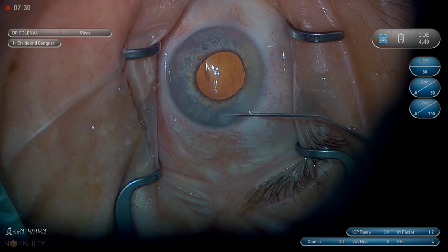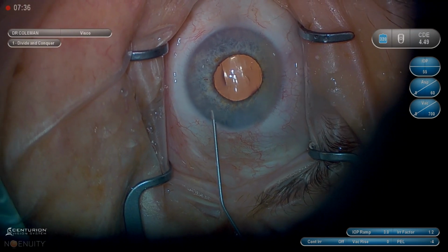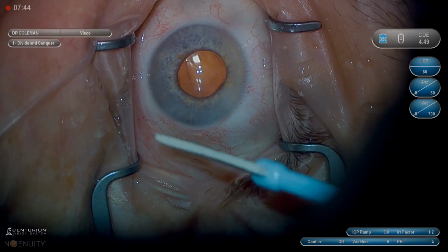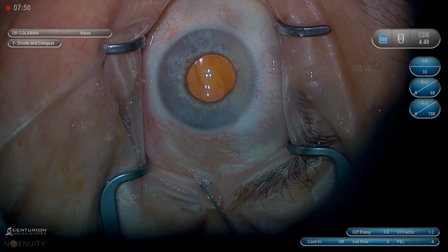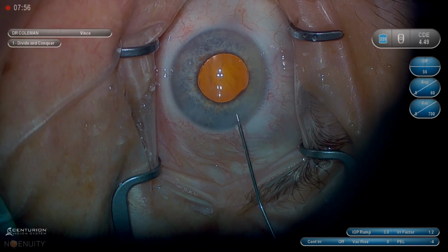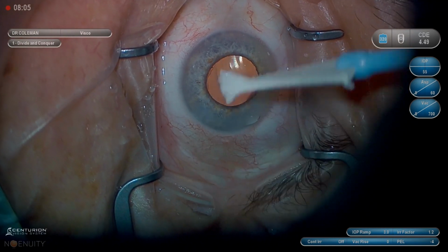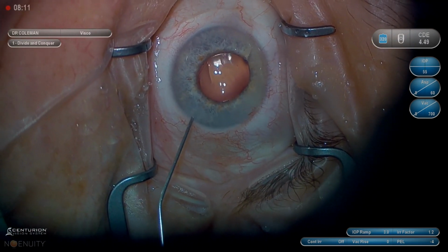So once the lens is injected, we want it to go in the capsular bag, but not point so deep. You're only pointing down to the point that you get it under the anterior capsular leaflet. That's where it's got to be. Don't keep pushing down and bulldoze through the posterior capsule. I've seen it happen a couple times in resident cases. So once it's under the anterior leaflet, then you can flatten out and just push it equatorial. You don't want the whole capsular bag complex to move as you're injecting in. So if you see that happening, that's when you start coming out of the eye in the final portion of the injection, so you don't destabilize zonules right at the end of the case.